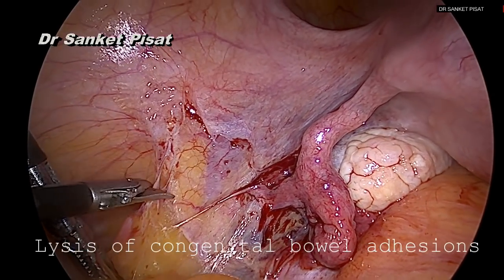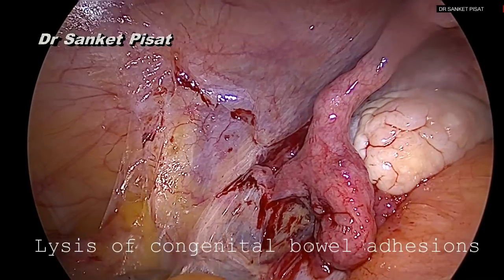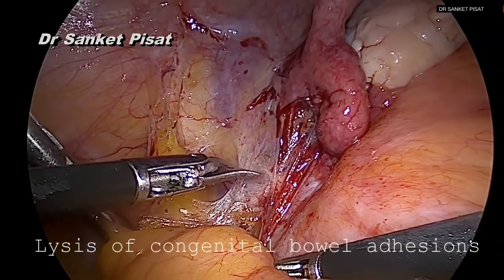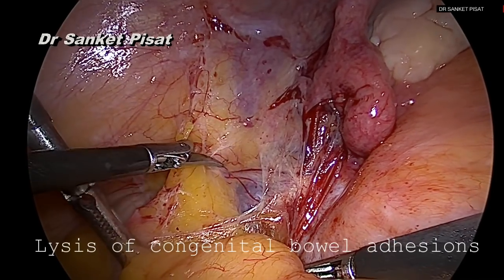We always see that the sigmoid colon is adherent to the left adnexal area and these adhesions need to be cleared off for a few centimeters at least, till the impression of the iliac vessels starts being visible, because this is the area that we are going to use to approach the great vessels.